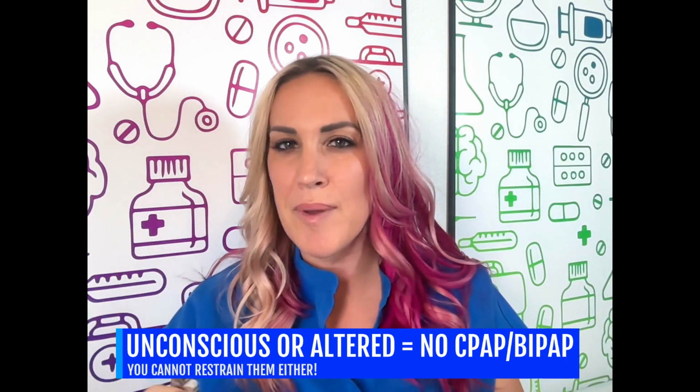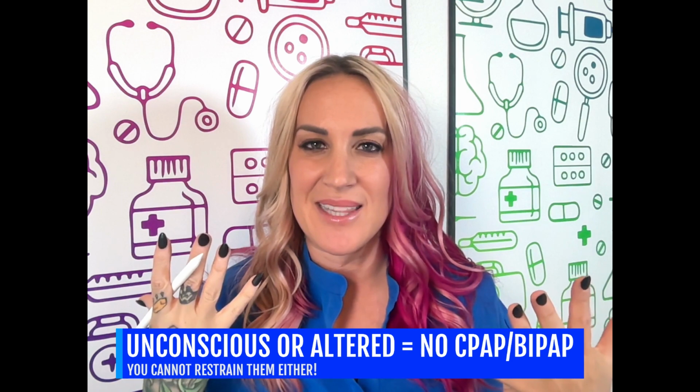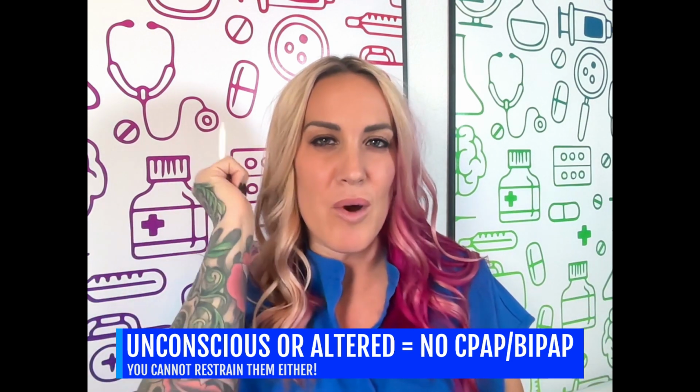So if they do not have the strength to remove this mask, they absolutely should not be on it. In addition to our drunk patients or our altered patients that don't understand why they need this mask, you cannot restrain patients either, because they won't be able to take this mask off. And I've seen this been done before, and I've gone in and taken these restraints off.